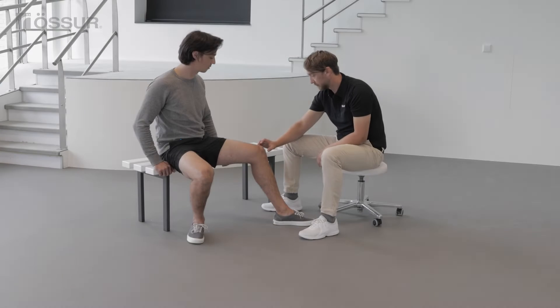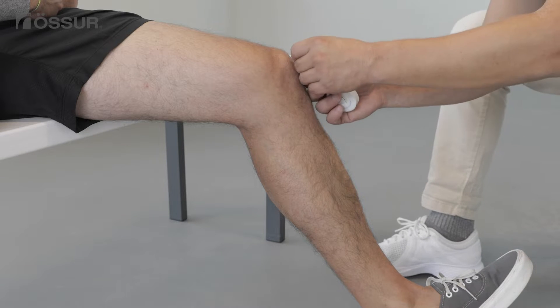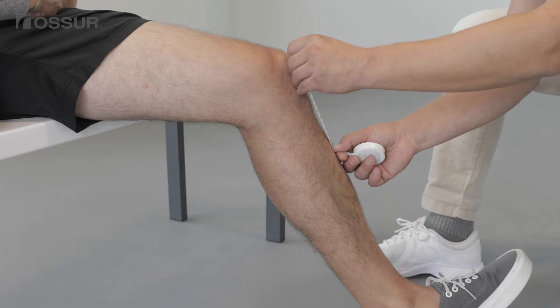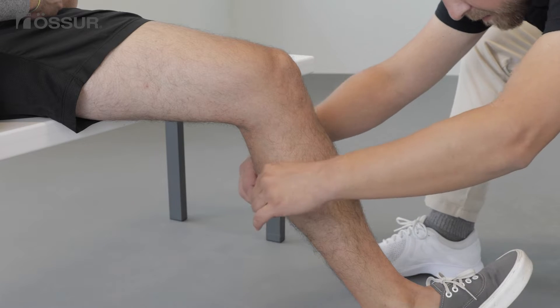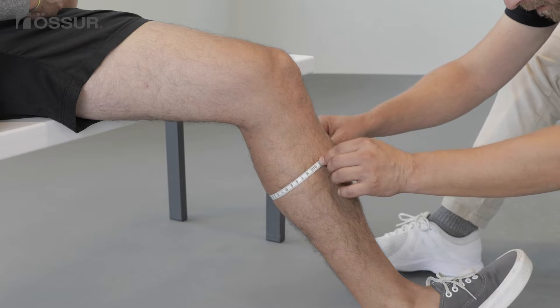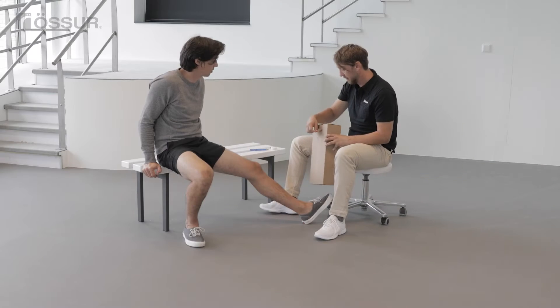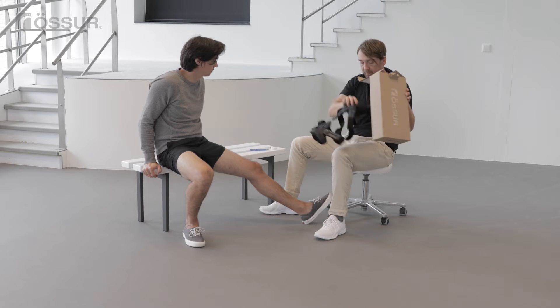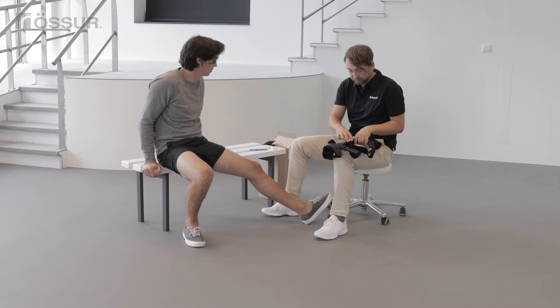The rebound cartilage brace has one size for each configuration and fits circumferences from 31 centimeters to 61 centimeters, or 12.2 inches to 24 inches. Find the spot six inches or 15 centimeters below the middle of the patella, then take a circumference measurement around the calf. The configuration required is selected according to which side of the knee is affected.